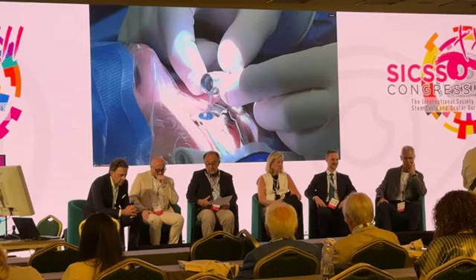The first step is to align the blade. You can see now it's aligned. I make 2 taps down to improve suction of the trephine. Which trephine are you using, just for the audience? It's a Baron trephine.